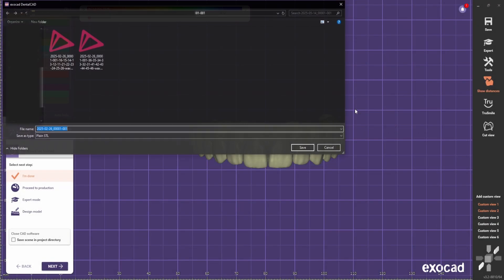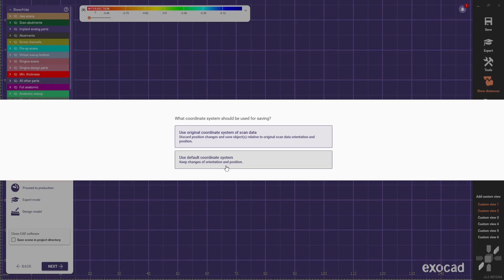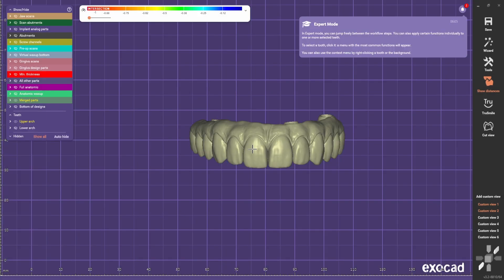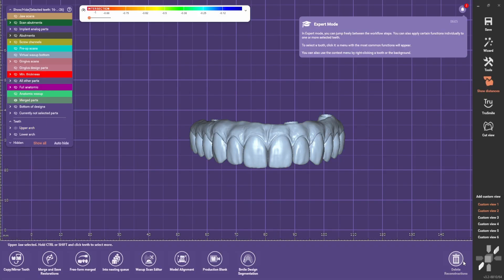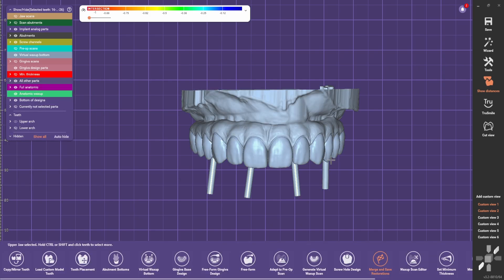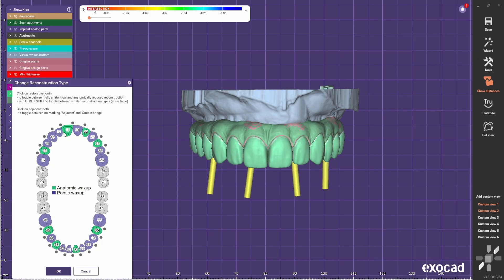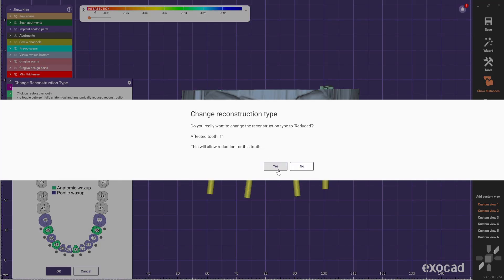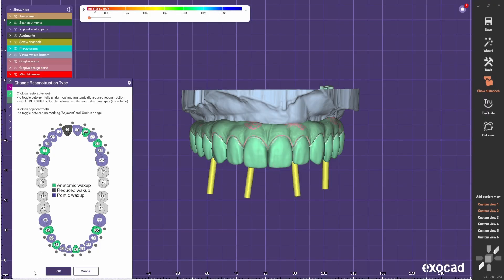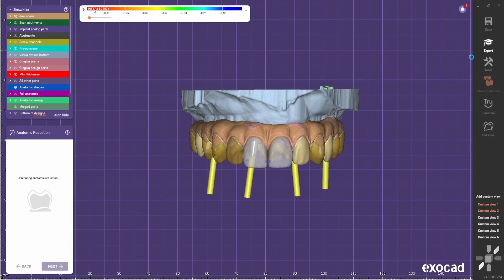First step is to export the full contour. Now I need to delete merged parts and change reconstruction type to reduced, because we're going to need to reduce the gingiva part of the full arch.